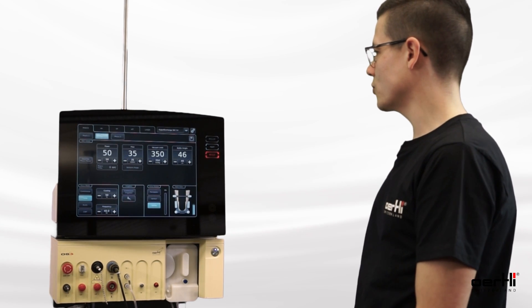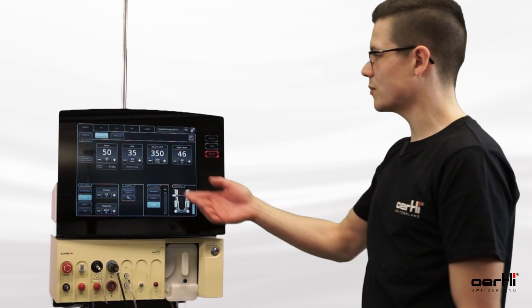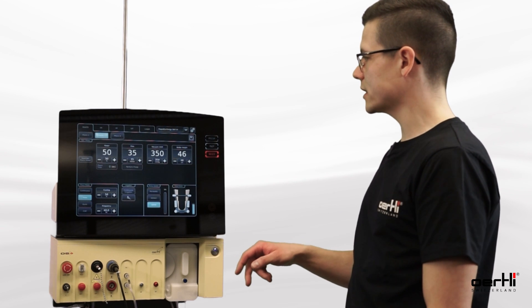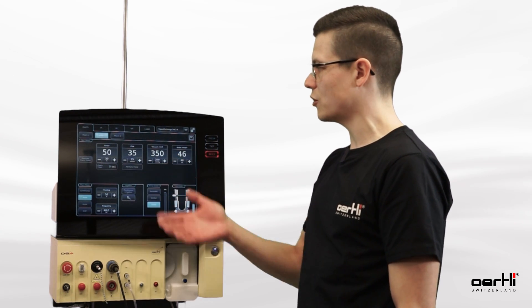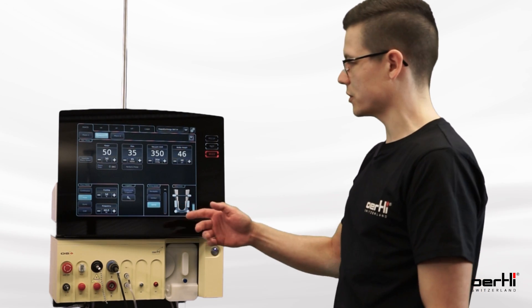The occlusion mode for the OS 4 is available for all three FACO modes. In this example I will show it with FACO mode 2. Here we start with the default values — this is how the device looks when you apply the new software and start up the FACO mode. Here you don't see any hint for the occlusion mode; we need to activate it first.